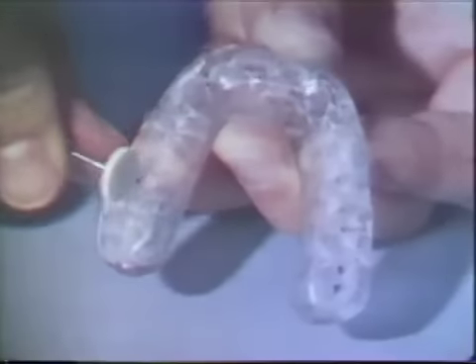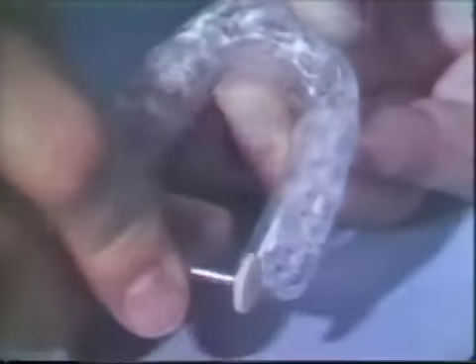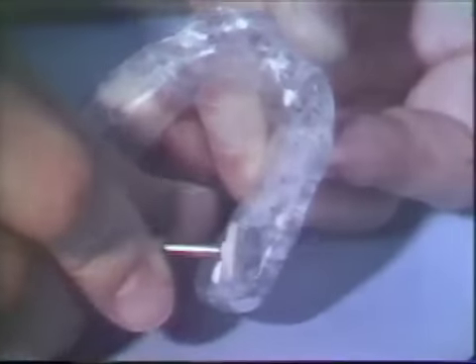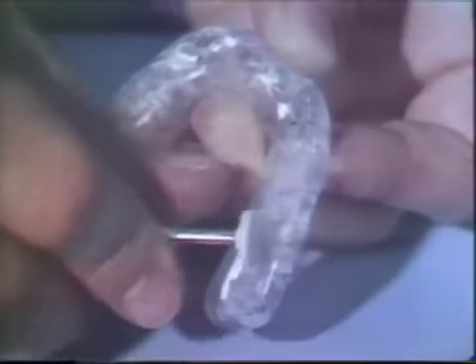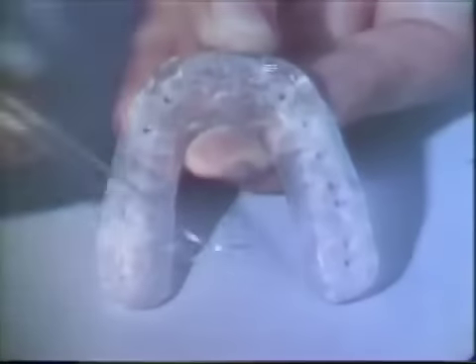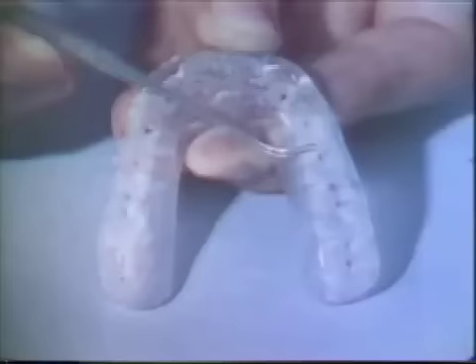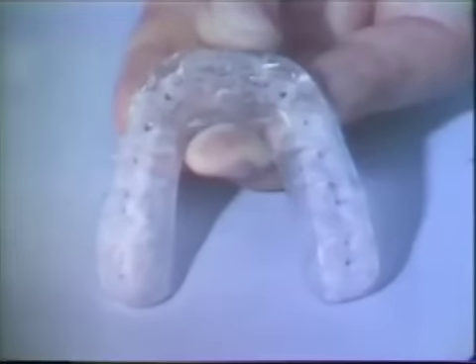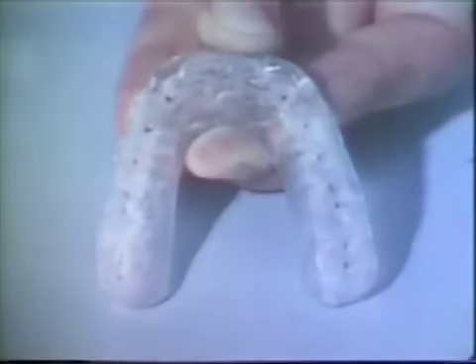More grinding is done on the posterior than on anterior contacts in order to bring all mandibular teeth into contact with the acrylic surface. The occlusion is tested again with closures made in centric relation. It appears that all the mandibular teeth are now making contact in centric relation. Because these contacts are on a flat surface, the patient will have freedom in centric and also have even contacts in unguided complete closures.